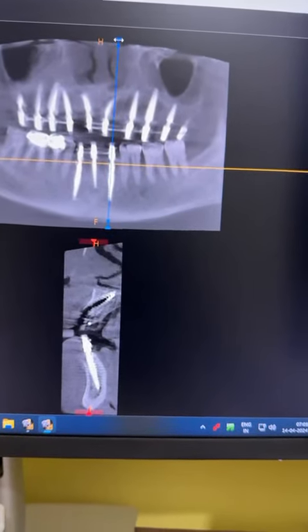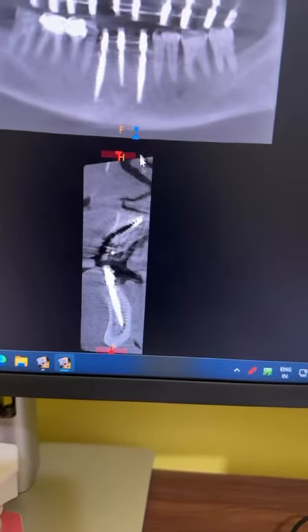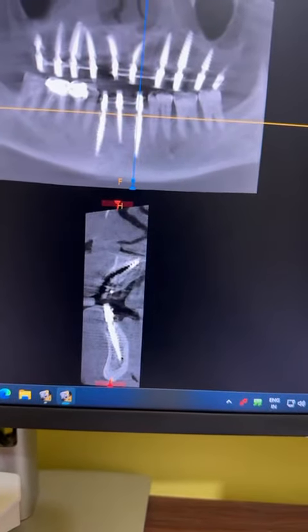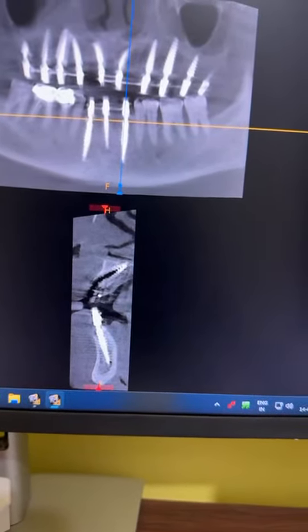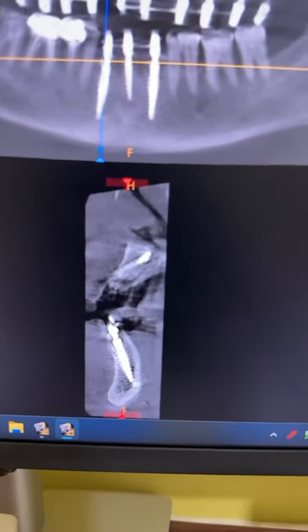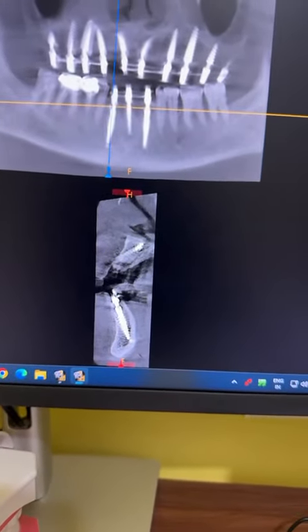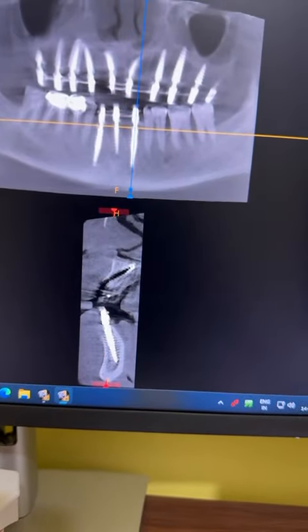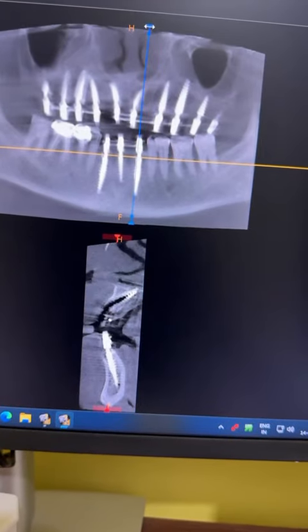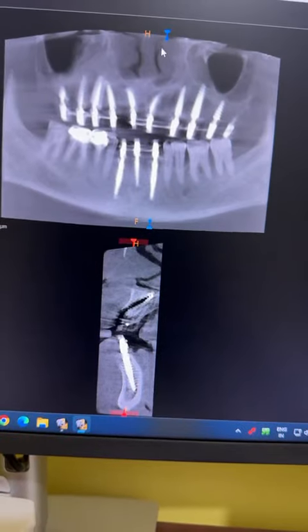This is also VCCx. This situation is not ideal for VCCx because the bone is osteoporotic, and it is not ideal for a compressive rough surface implant either because buccally there is a bone defect in the canine area. However, these situations are ideal for VCCx since there is a smooth surface — even if there is very little buccal plate or a defect in the buccal plate, it does not matter. By its design it will get good stability even in osteoporotic bone.